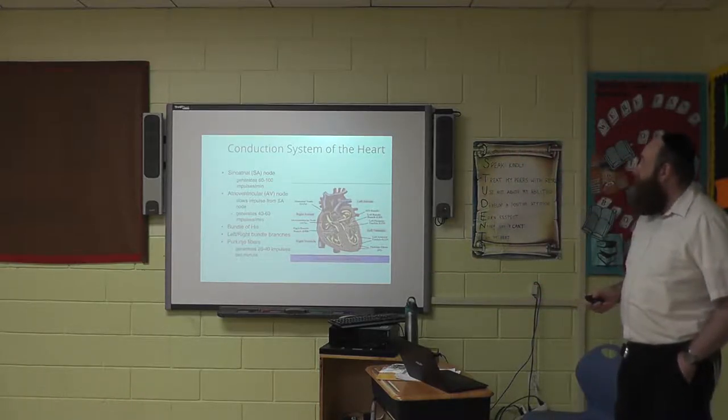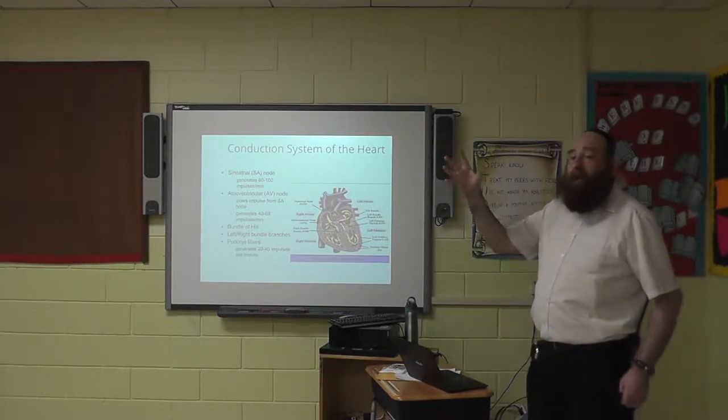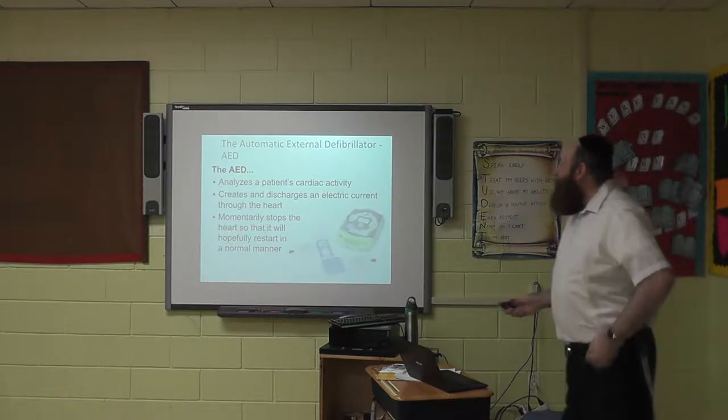So when they're in VFib? When they're in VFib is when the electricity is not causing any sort of systole and diastole, just the quiver. We'll get to it. So what is an AED?